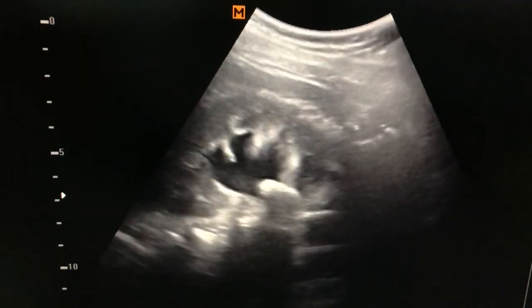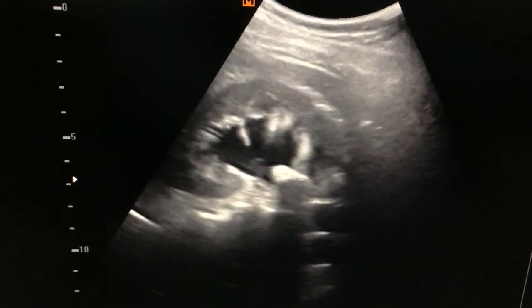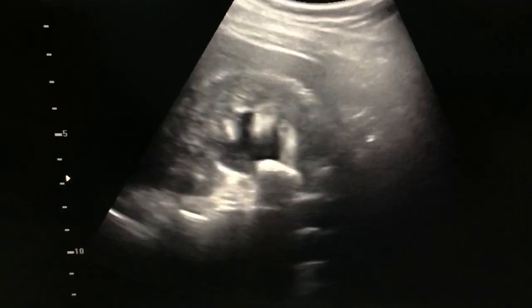This is the longitudinal view of the kidney, and here is the large calculus. It was measuring 21 mm in the pelvic ureteric junction.